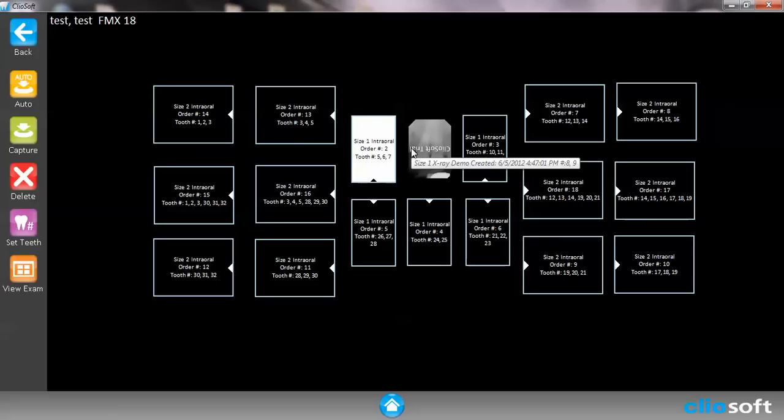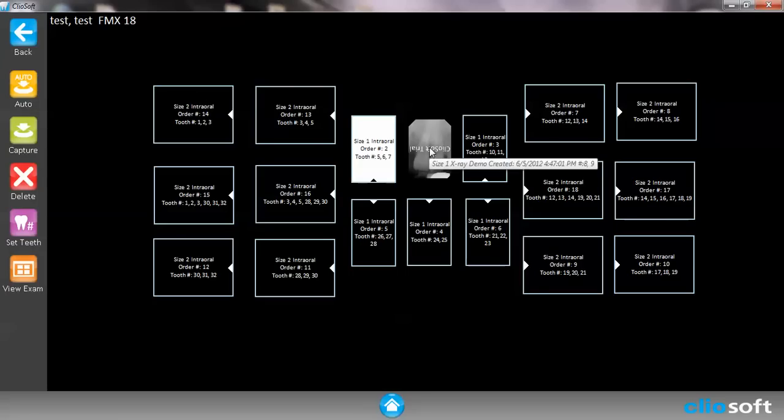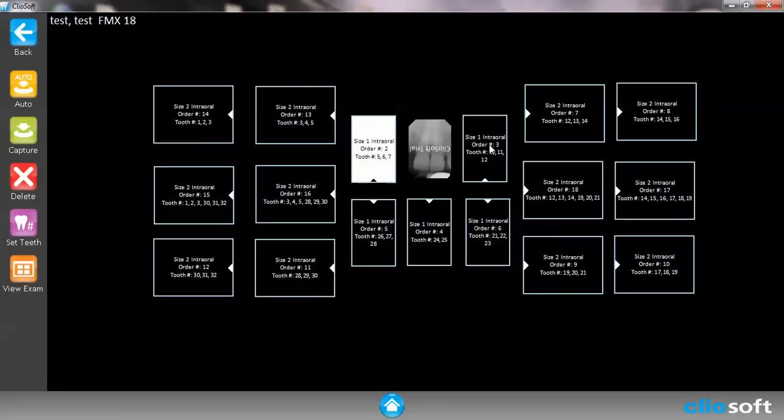We also have an automatic button where it will move to the order that you choose. If you look at the placeholders you'll notice that this one is number one, number two, number three, four, five and it'll follow that order if you hit the auto button on the left side.